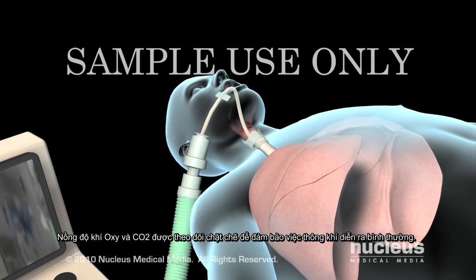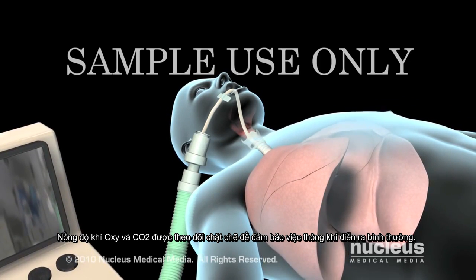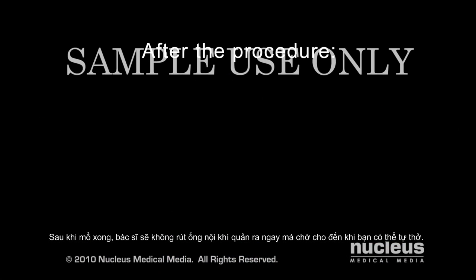Levels of oxygen and carbon dioxide will be closely monitored to confirm that the ventilator is working. Once your surgical procedure is complete, your doctor will not remove the endotracheal tube until you are able to safely breathe on your own.